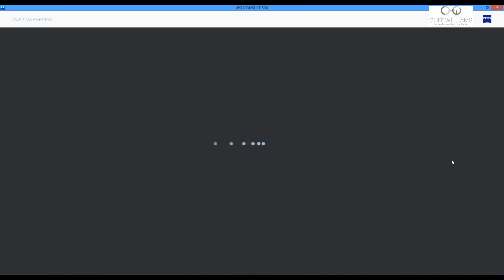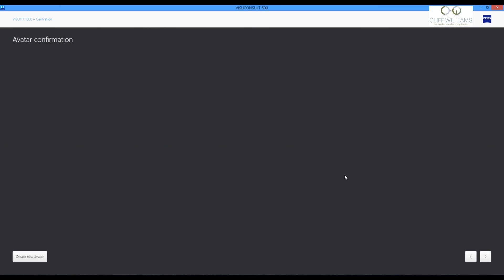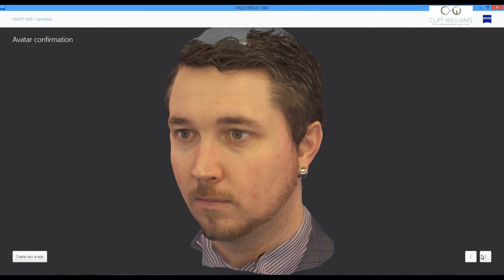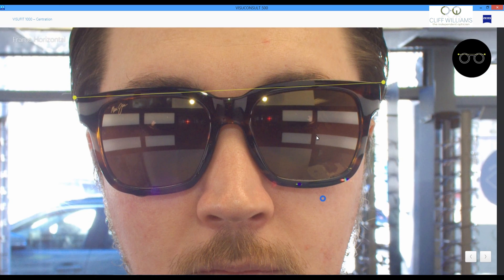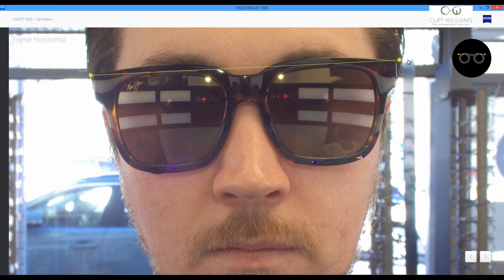So we've got the straight on picture. We'll tell it that it's not visible from the middle or the side of the picture. We'll bring in this avatar that we've taken without the sunglasses on. Put a marker over the top of the frame.